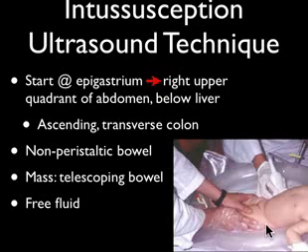But to diagnose it, we're here with the ultrasound probe, looking at the ascending and then across to the transverse colon for any areas that are non-peristaltic, because these intussusceptions don't peristalse. Normally, peristalsis occurs about every 8 to 10 seconds, but you can stare at this bowel, it's not going to peristalse, and you'll see a mass or a target sign.